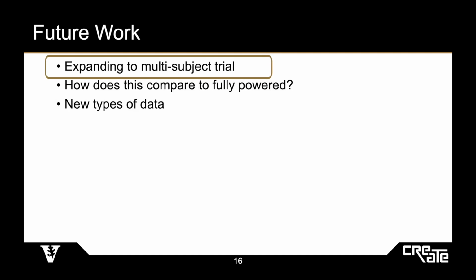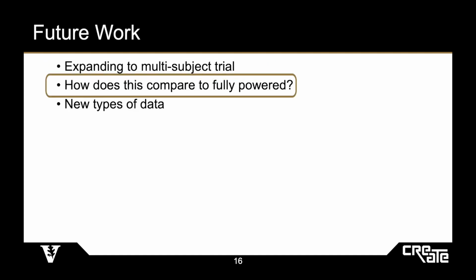While the results of this work are promising, we know that this study needs to be expanded beyond a single subject. Additionally, we recognize that the ability of powered knee prostheses to add large torques could be impactful to the stance phase of stair ambulation. For this reason, we are collecting data to analyze stair ambulation ability and user comfort for a damped knee, a fully powered knee, and our device.